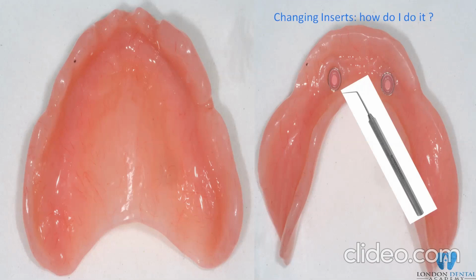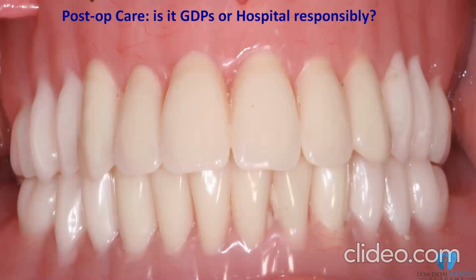I don't have videos on this, but I will probably show it to you at some stage where you can practice this, and you'll find it very, very easy. All you need is to keep in stock these cheap inserts in different colors, again from clear, pink, blue, green, and I think black, which are the lab-based inserts.